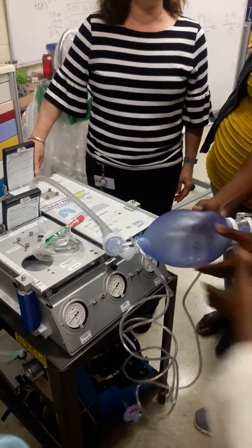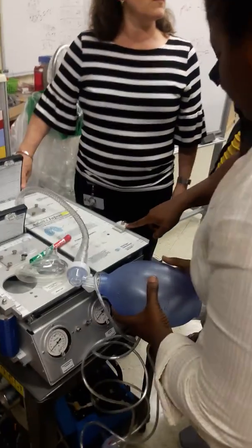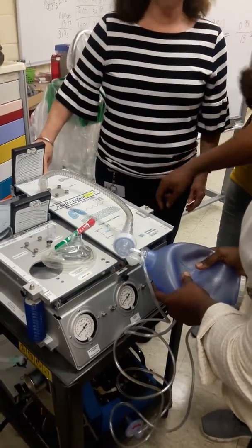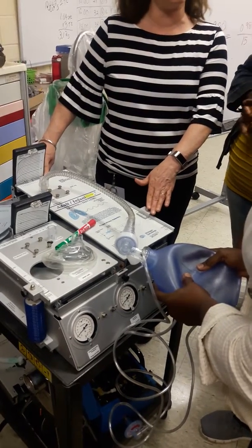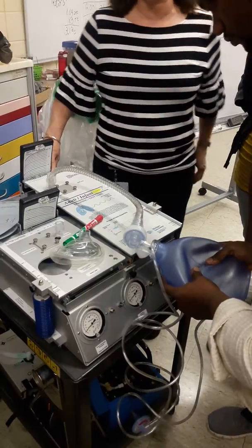This is normal compliance. When it's compliant, it's easier to get the pressure in. Less compliance means more pressure is needed. This is how I change how easy it is. You see how it's 5? That would be your plateau pressure, where you pause right there.